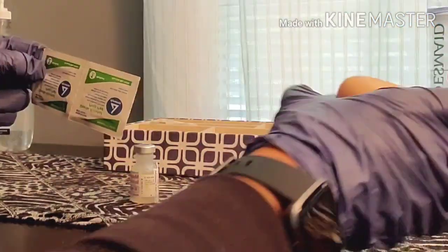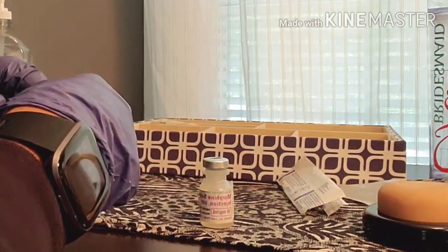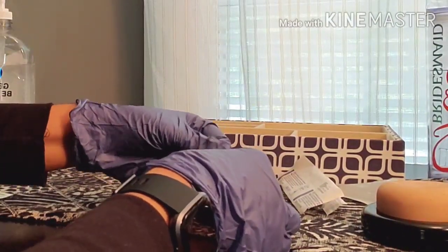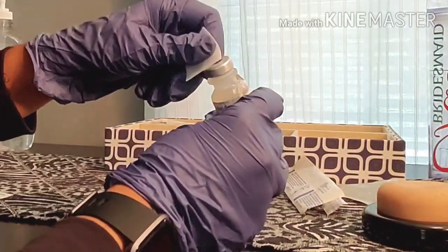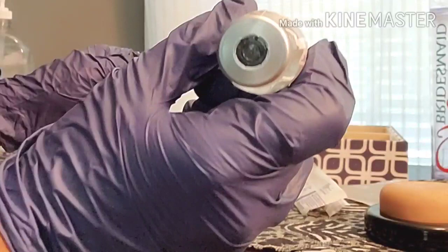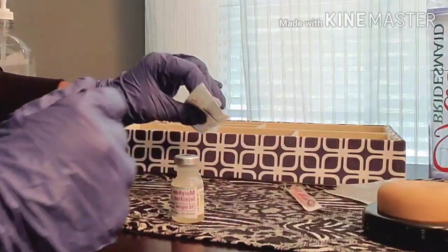The first thing I'm going to do is clean the vial. I'll clean it vigorously for 15 seconds, making sure to clean right in the center, which is where my needle will be going in.